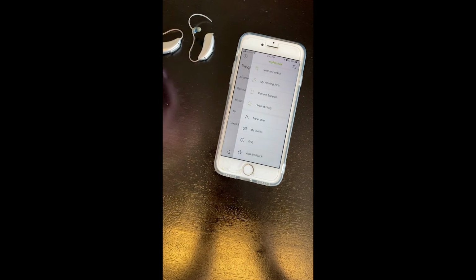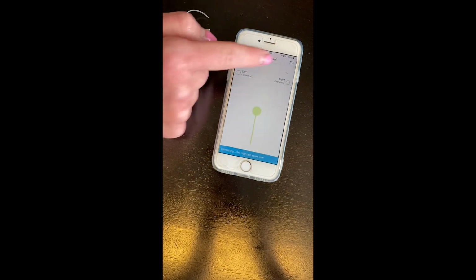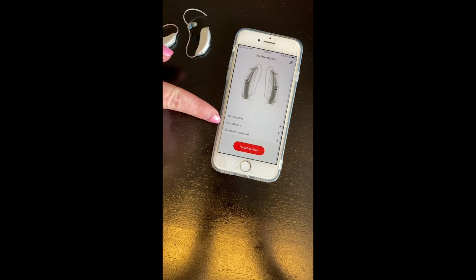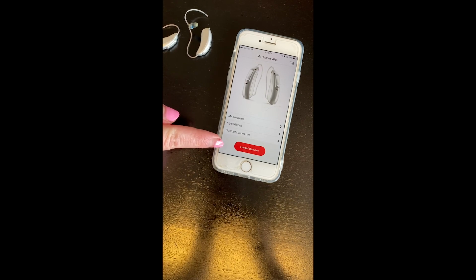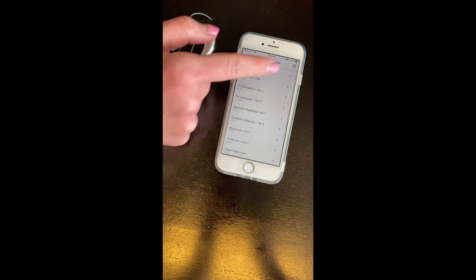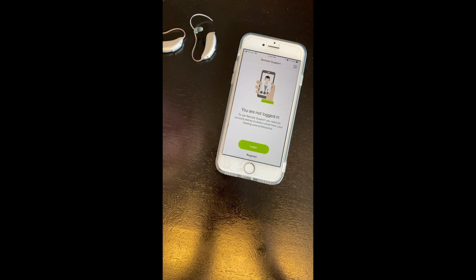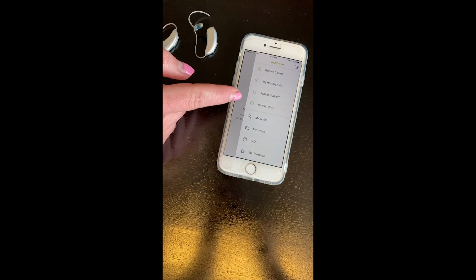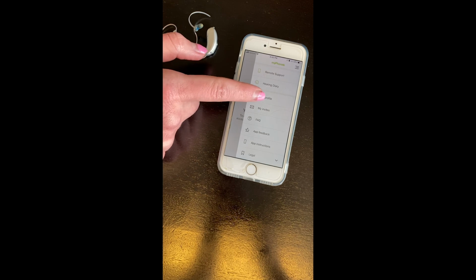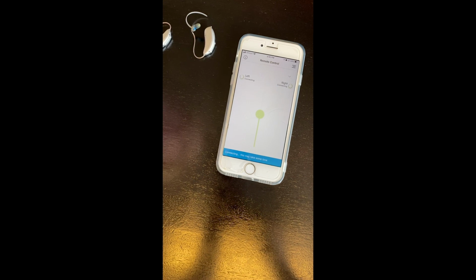And if you go up to that little part here, you can go back to your remote control, or you can go to My Hearing Aids, and I would never press forget devices unless you don't have these hearing aids anymore. It'll teach you about all your different programs you have, remote support. You can talk to your provider about that one. And then hearing diary, you can look into a lot of these things and just learn a little bit more about it. But for the most part, remote control is going to be where you want to be.